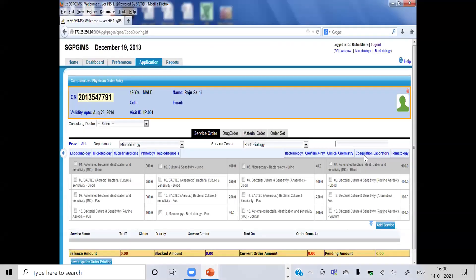There is an aerobic culture bottle and an anaerobic culture bottle — an orange-colored bottle and a blue-colored bottle. There is also a pediatric vial with a slight pink color, because we cannot withdraw a large volume of blood from children — three to five ml may be withdrawn. The optimum volume for an adult blood culture bottle is 8 to 10 ml in each bottle, making a total collection of 20 ml.